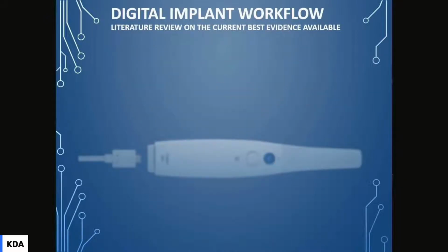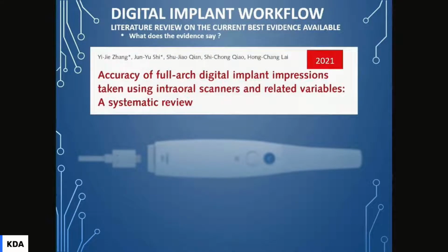So we know from the literature that restoring implants using digital workflow is limited to single implants and small span bridges. Can we exceed that? Can we do more than that? Let's take a look at the literature. What does it say? I found a recent systematic review in a very well-known journal.